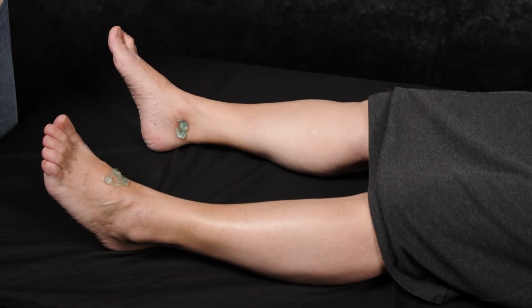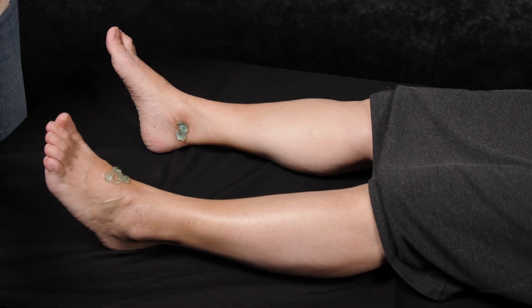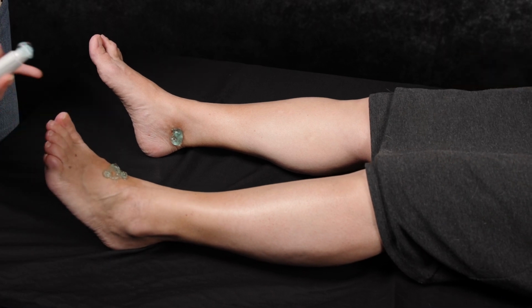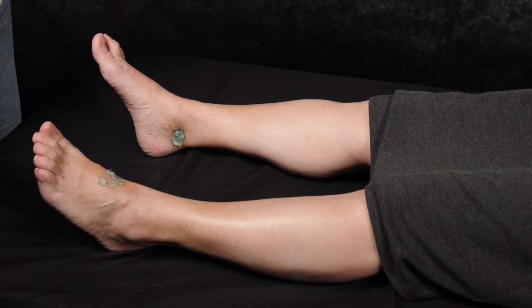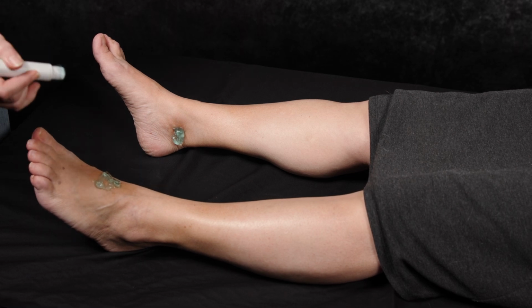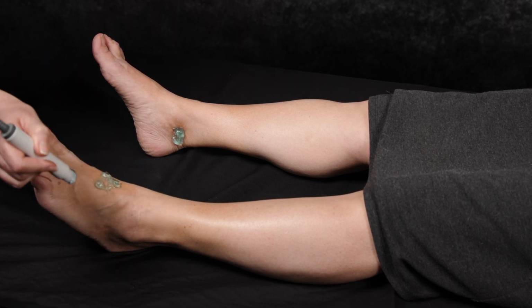One thing to remember when you're using the Doppler on your patients is that sometimes it can be very difficult to locate the pulse, especially when you've got lots of edema or adipose tissue, remembering that these vessels can be just a few millimeters in diameter. One technique that's helpful, I find, is using a snake or an S-shape approach across the top of the foot.